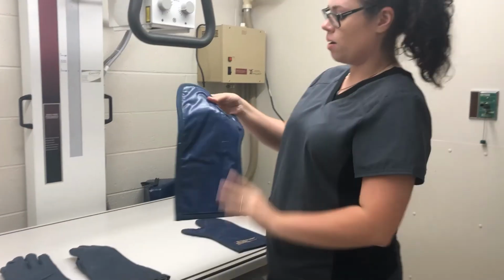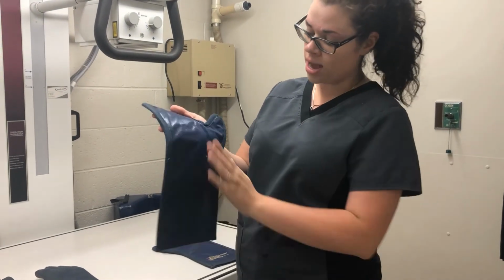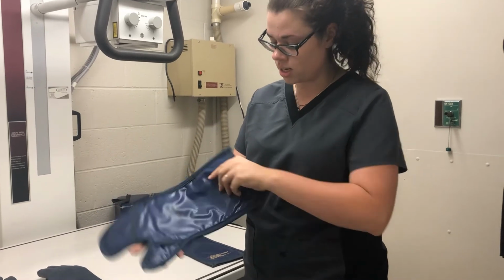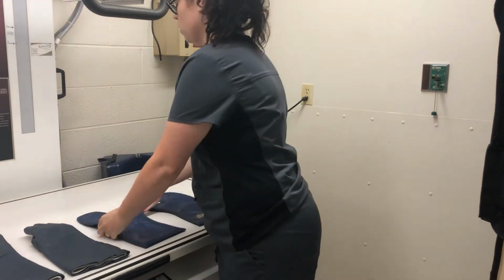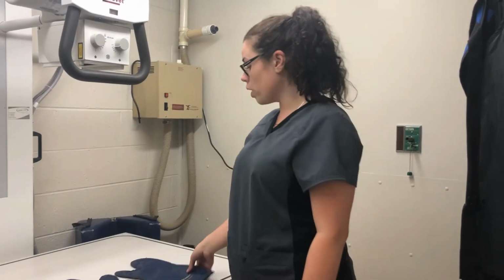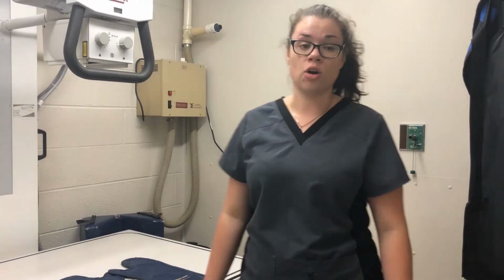They just don't look good. And then we have our mittens that we use, and they are actually looking better than our whole gloves. No real wear and tear on these, and the lead is intact also. We do check these, I believe it's quarterly, with our X-ray machine to make sure that they're still working well and they haven't been worn down, and those were checked recently and they're all good.